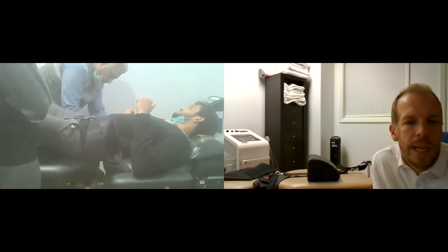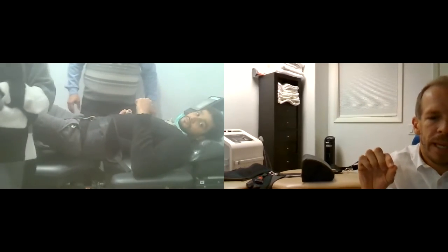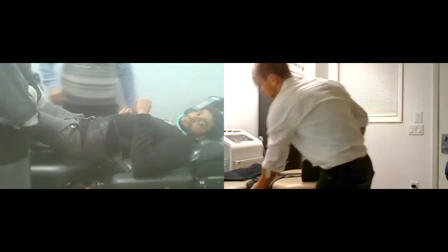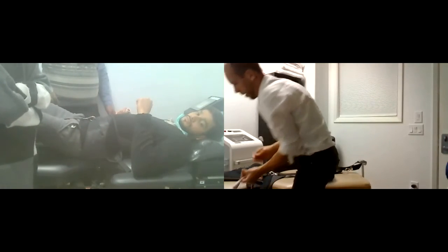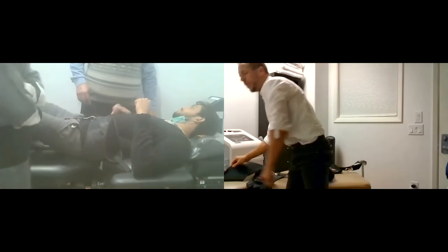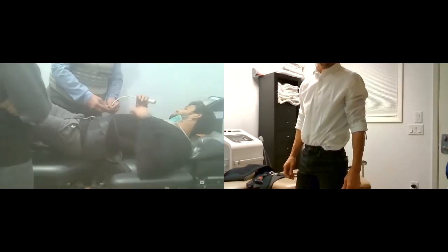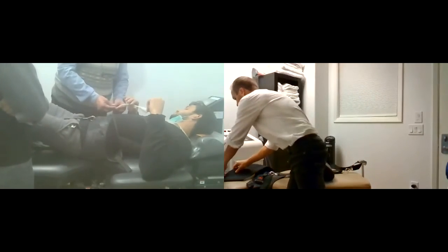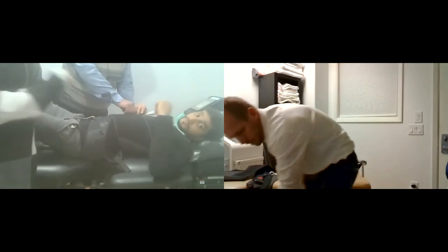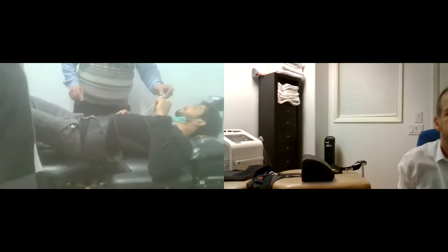When you give it to the patient, you can use that little clip and just clip it right onto the harness, or onto their shirt, or wherever you want, so they don't have to hold it the whole time. Otherwise, they might accidentally push it.